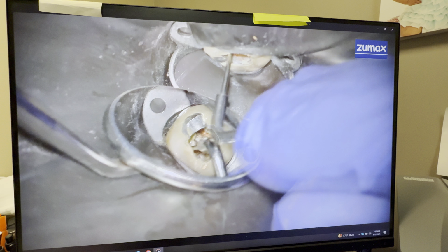Distal buccal, that was missed and we located, is going to 21. Distal lingual also is patent. And this, again, was isopropyl alcohol. All right, now I switch to 6% hypo. That's 6% hypo now, irrigating copiously with.